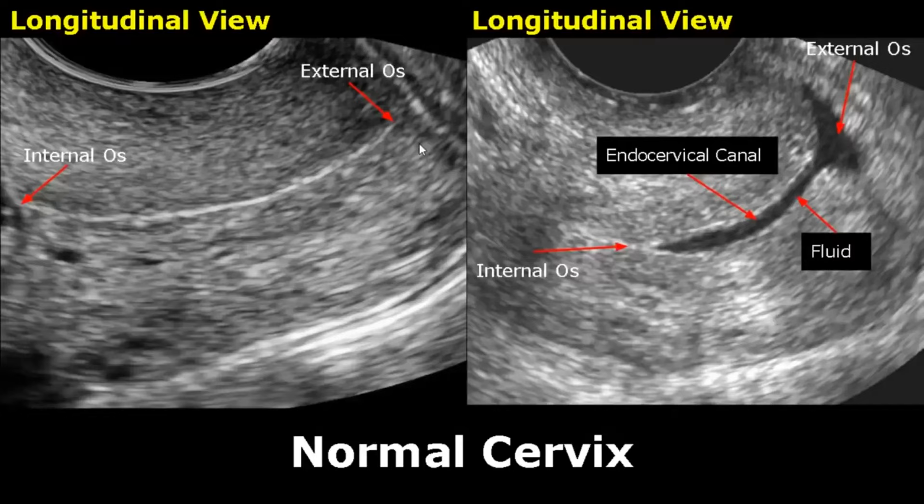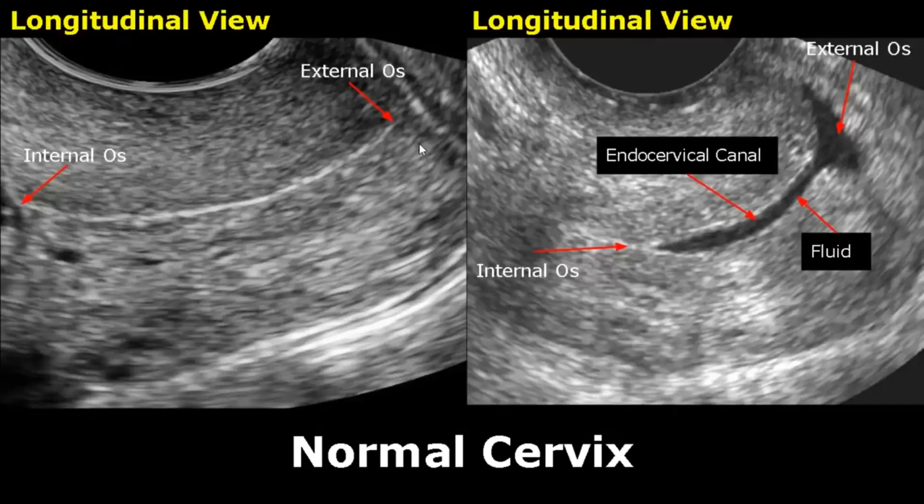Hello everyone, this is Dr. Sam and this video is about cervix ultrasound. The cervix is the lower end of the uterus and is often overlooked when scanning, but it is important to view it. These are transvaginal images of the cervix in longitudinal view.